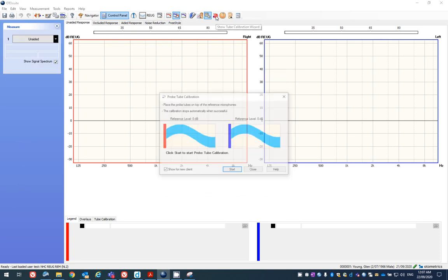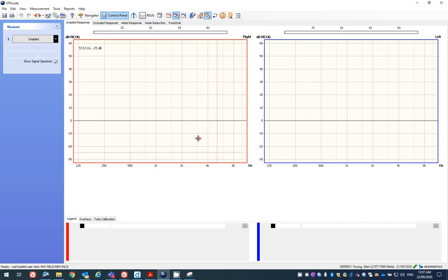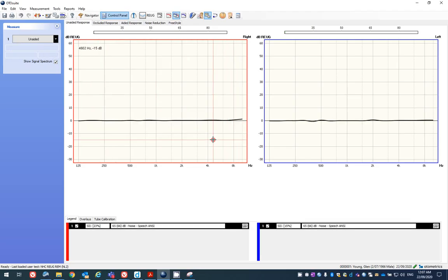Okay, now if we run our tube cal, great, we can hear the sounds, getting a proper response, and we've got a successful tube cal. We're now ready. We can test that with the Freefit in the same position. If we run an unaided trace against that, we should get this nice flat response back. That means that everything's working, calculated properly, and cancelled out everything properly.